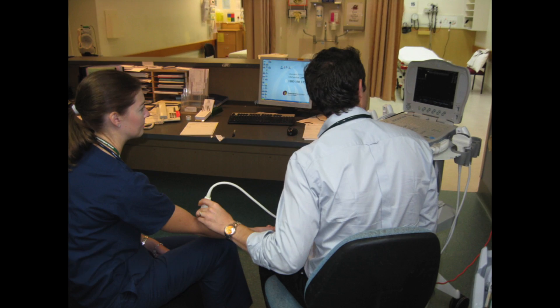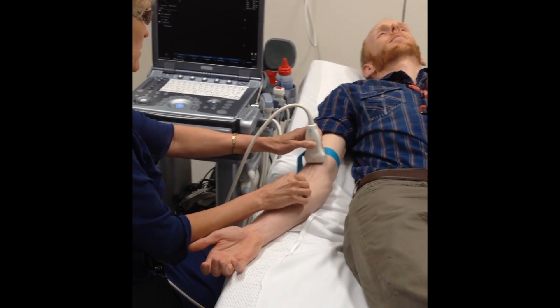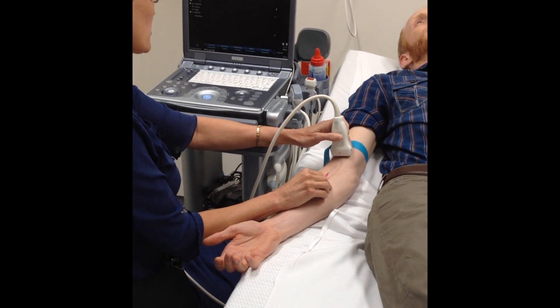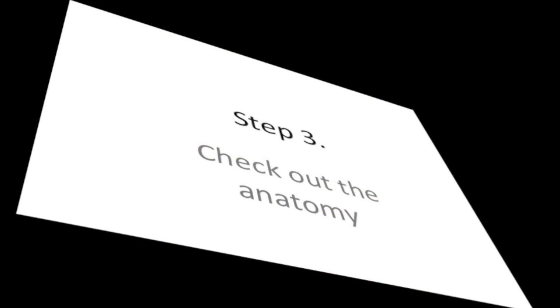Choose your position with care — sitting if you possibly can, certainly not twisted across your shoulder. You want yourself, the probe, the patient and the screen in alignment such that you barely need to move your head to see.